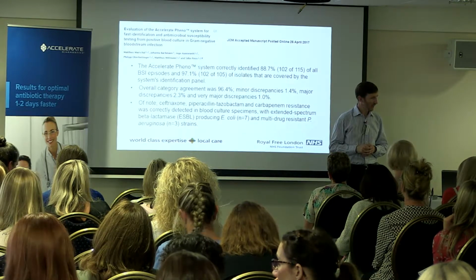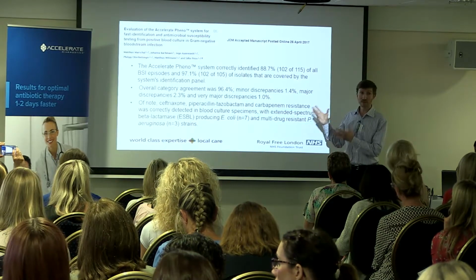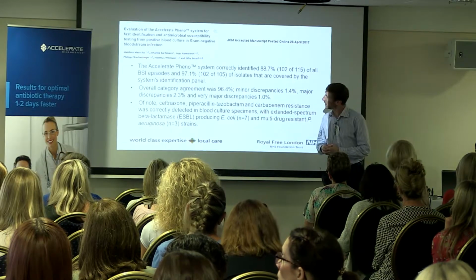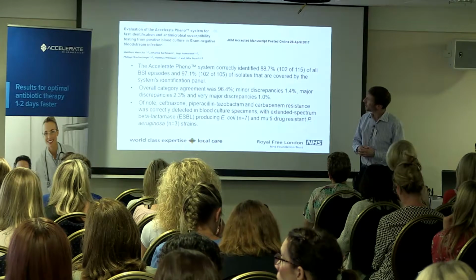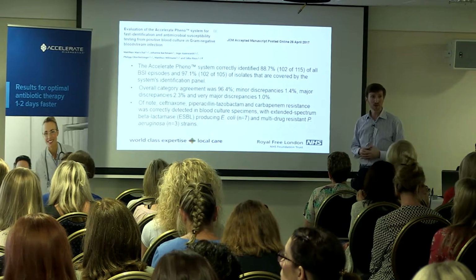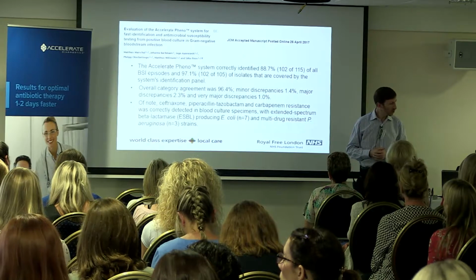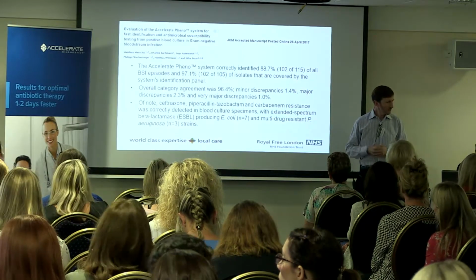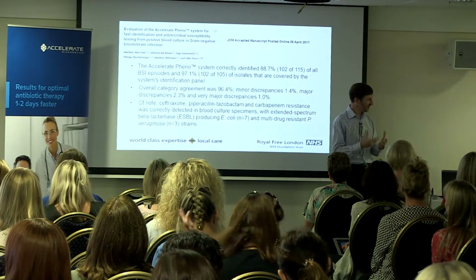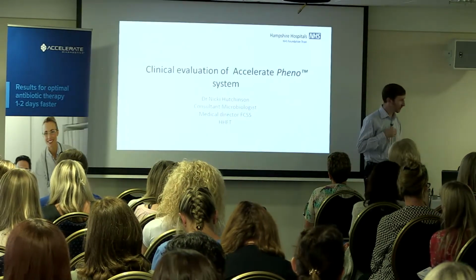And a recent paper from another group looked at the same thing, the gram-negative organisms in their service. I think this was in Germany, in Tübingen, and their results showed the sensitivity testing was very accurate, but they haven't gone on to measure the impact of that. So a lot of ours would probably be overthinking the problem at the Royal Free, but we're about to hear from Nikki where they've really applied this in the clinical setting to their patients. So thank you, and I'll hand over now.